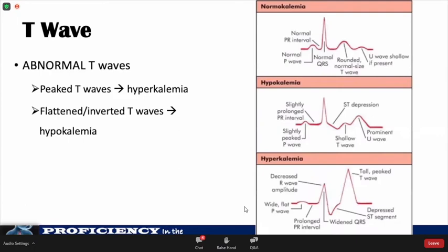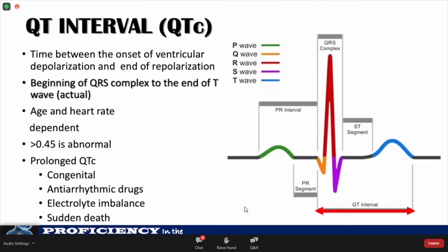Certain metabolic disturbances can cause abnormal T-waves. Peaked T-waves taller than half the size of the preceding QRS may be seen in hyperkalemia, while flat or low T-waves may occur in hypokalemia. The most important interval is the QT interval, which represents the time between the onset of ventricular depolarization and end of repolarization. A long QTc of more than 0.45 seconds is abnormal and can result in sudden death.